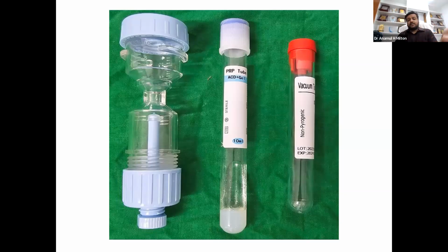Another is the vacuum tube. Here there is no gel and no ACD. We use this when we prepare the patient: we take 2 ml of ACD inside the syringe and 18 ml of blood, so a 9:1 ratio. After that we use two of these tubes, giving 10 ml and 10 ml.